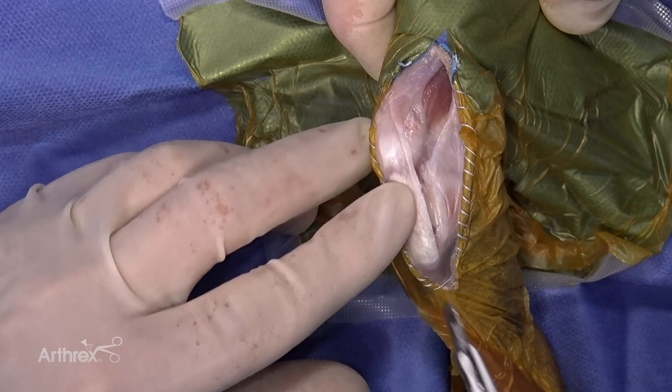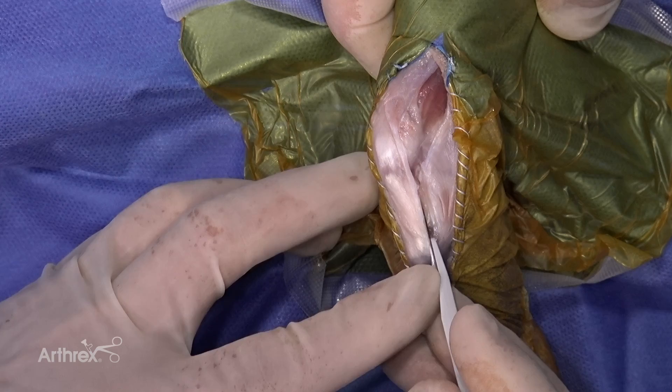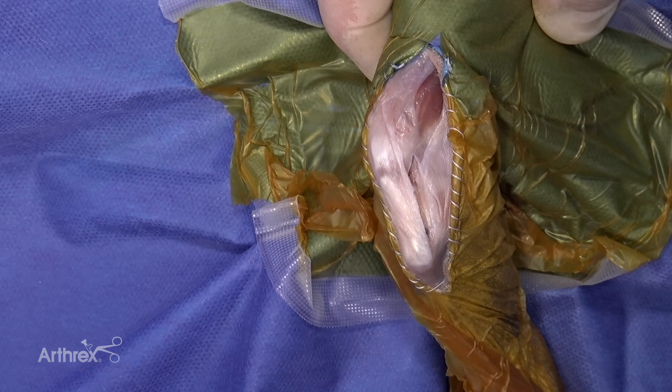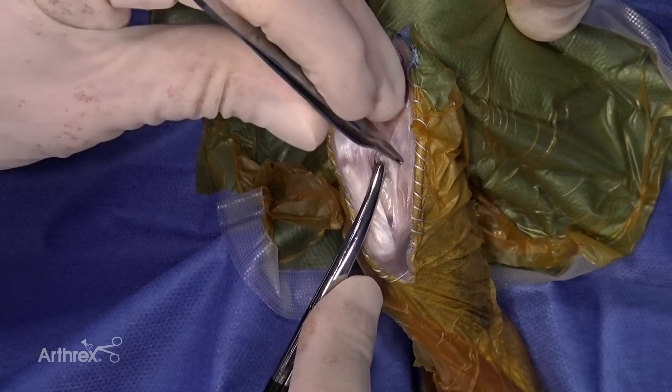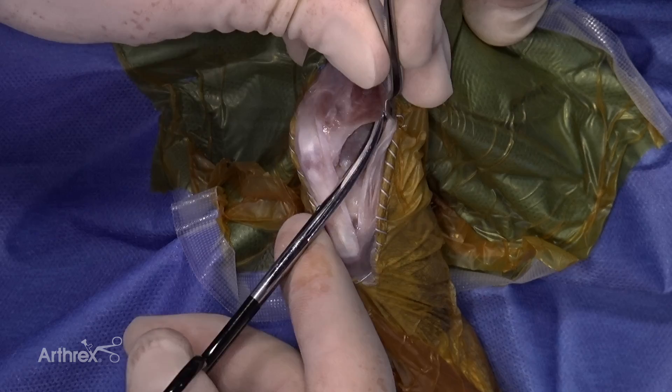Now we're going to enter the joint. The best place to enter the joint is just below the patella. If you come down into the lower region you're getting into fat pad and won't get into the joint. We'll make a nick into the joint right here and carry that on with scissors. When you carry this incision proximally, don't come through the vastus — come along the caudal border of the vastus.